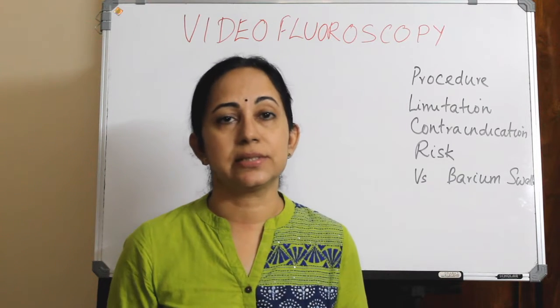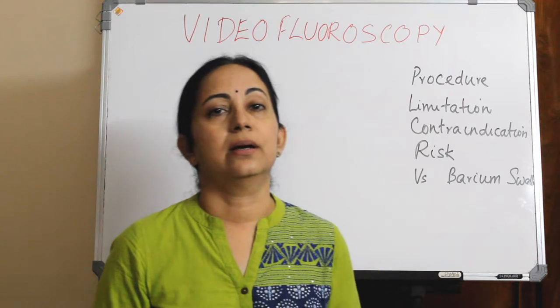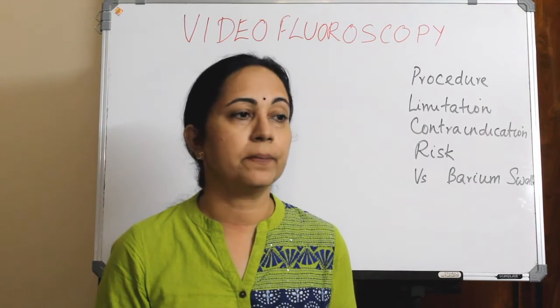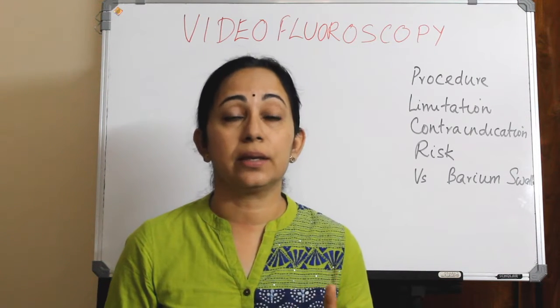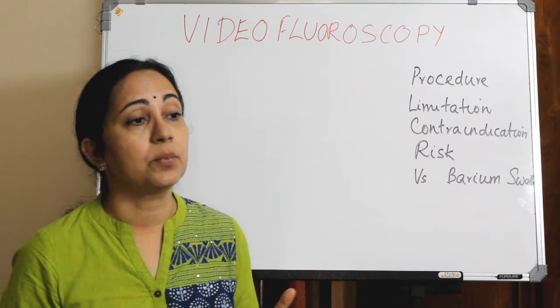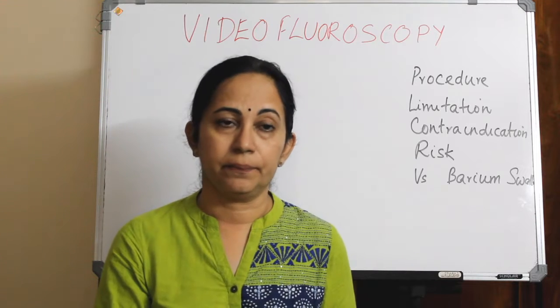Actually this needs a multidisciplinary team for doing a correct interpretation and the procedure of fluoroscopy. By fluoroscopy we can find out the cause of dysphagia and also decide on the correct modality of treatment, and this can be shown to the patient.